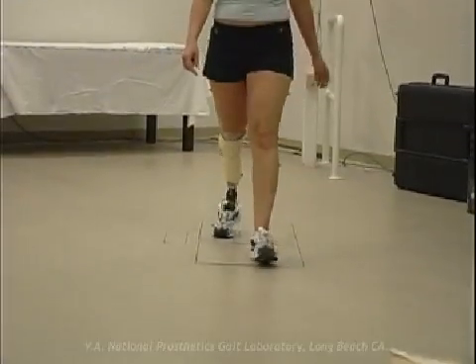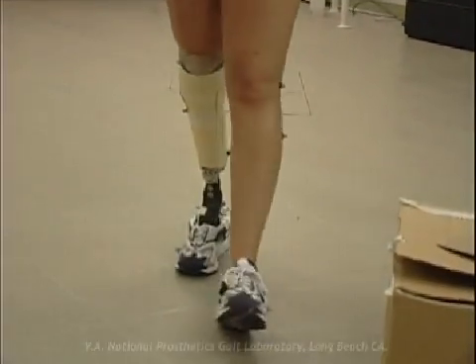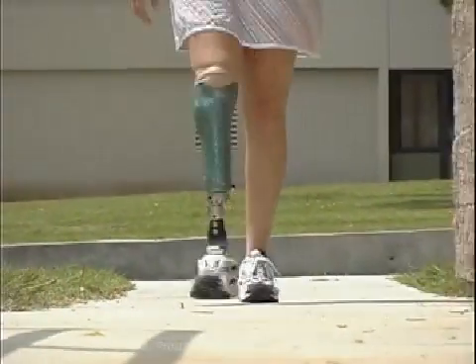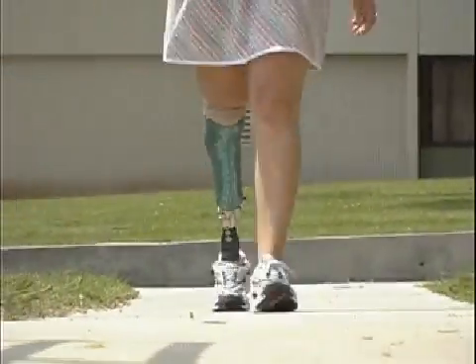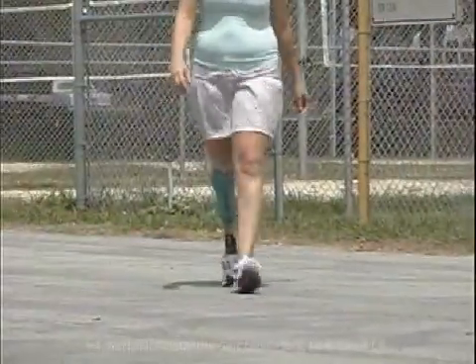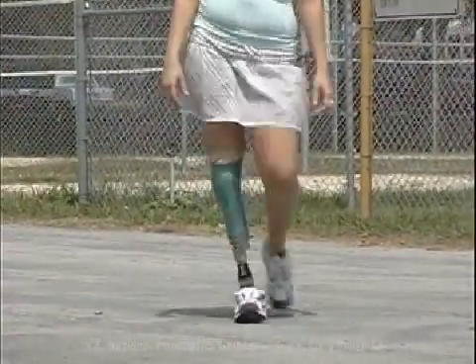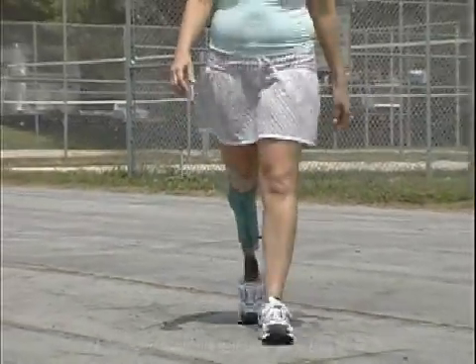During ambulation in a prosthesis, in the coronal plane, the foot should roll over evenly on the floor during stance. If the individual is walking on the lateral side of the foot, even though the foot is placed under the knee center appropriately, as seen here, the socket may be in excessive abduction relative to the anatomical position of the amputee's limb.